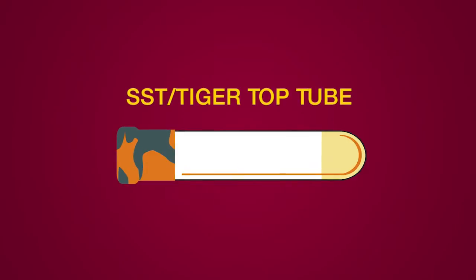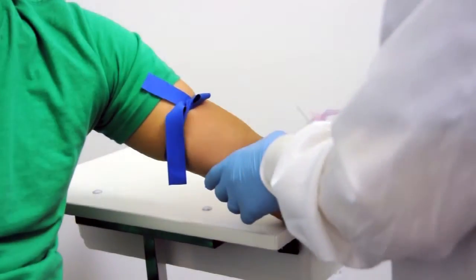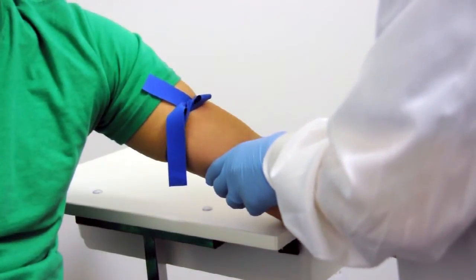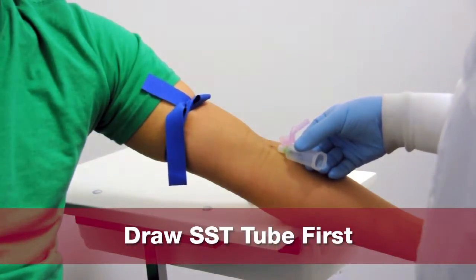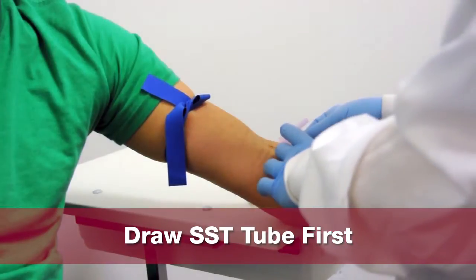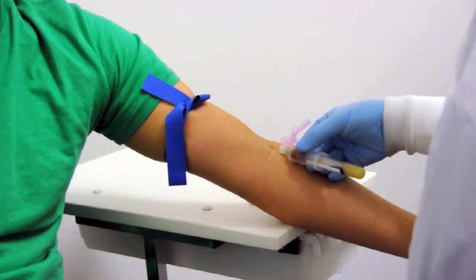SST Tiger Top Tube. We will now demonstrate the sample handling process for a serum separator tube, also known as an SST or Tiger Top. This process is also the same for the NMR lipo profile tube. It is important that you draw the SST tube first, in most cases, because of possible cross-contamination due to anticoagulant present in other tubes, such as the EDTA lavender top.